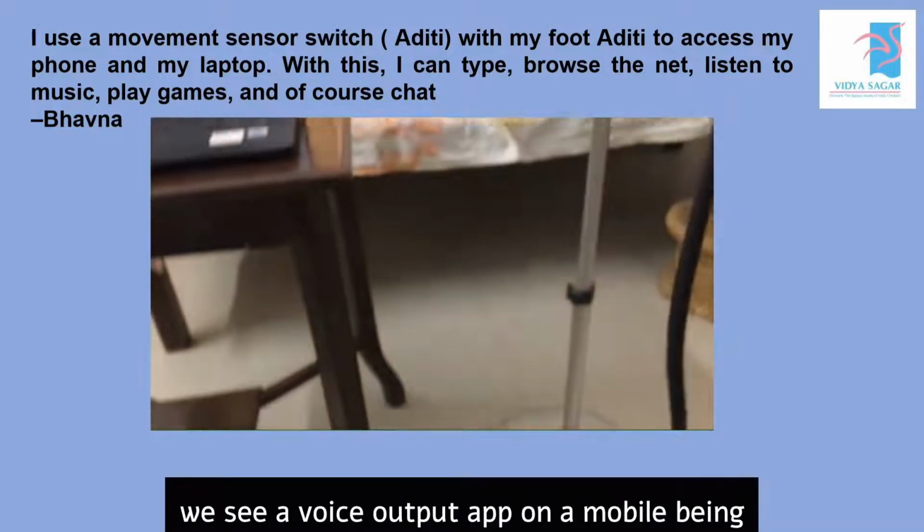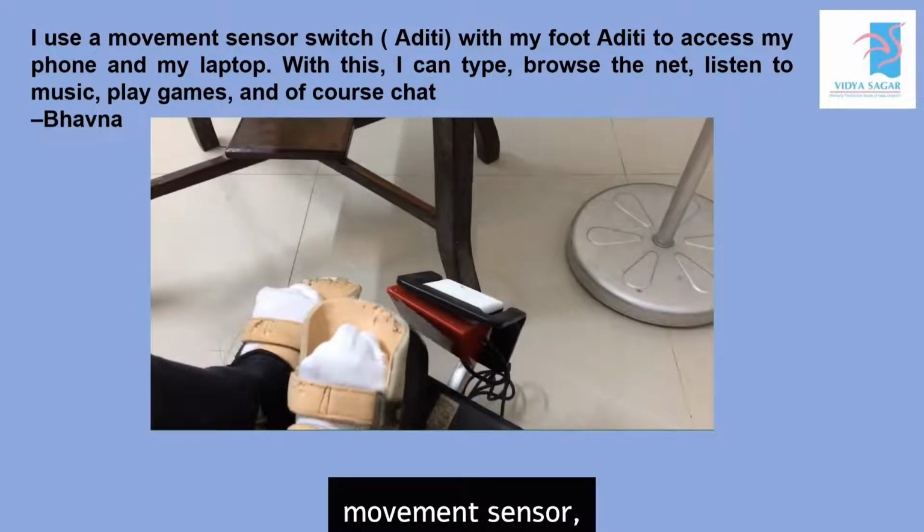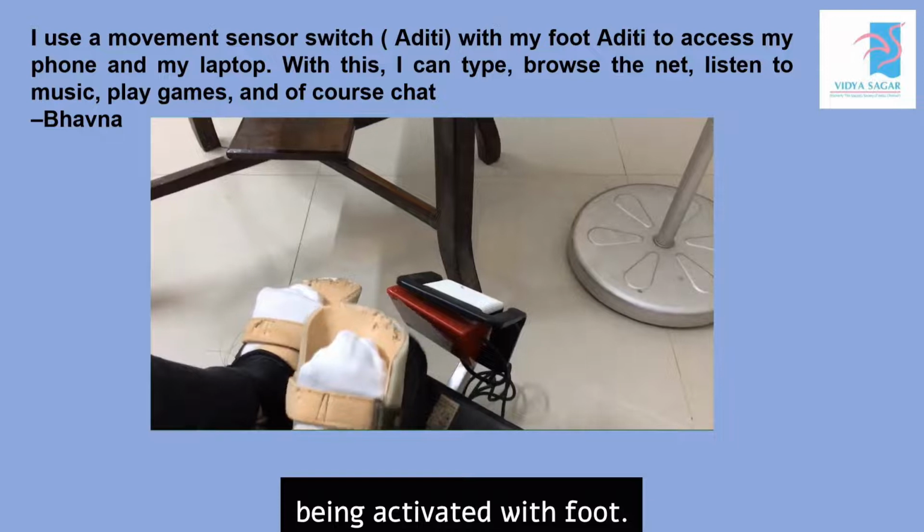In this, we see a voice output app on a mobile being used with an Aditi movement sensor switch being activated with foot.